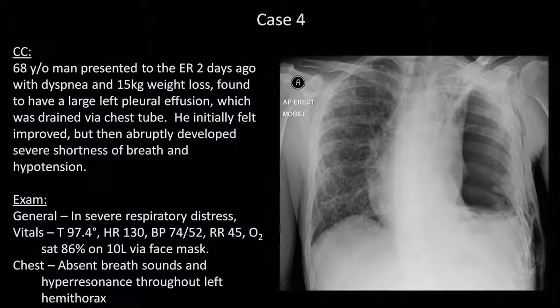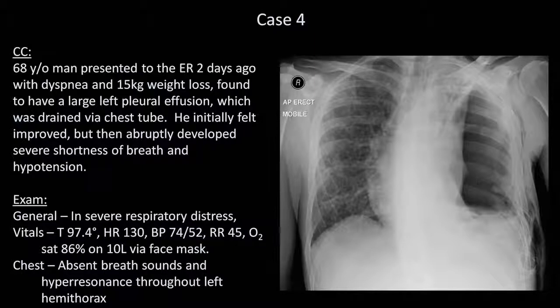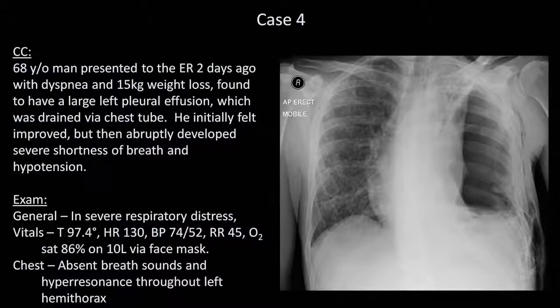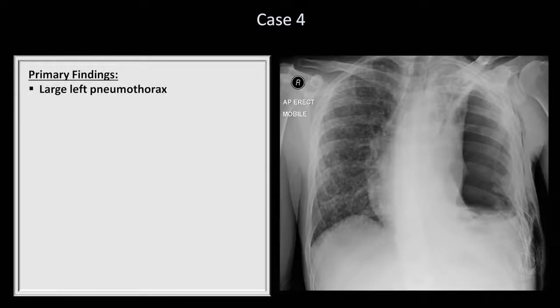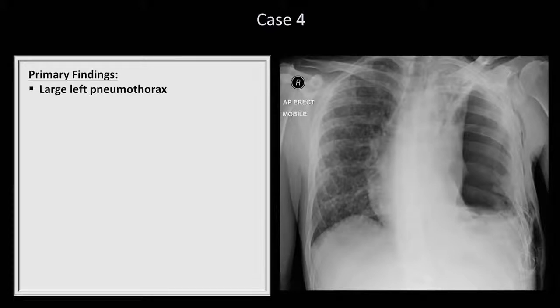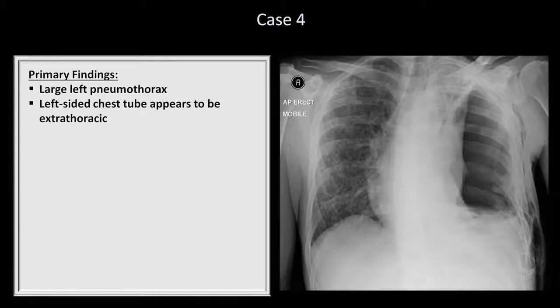Case 4. A 68-year-old man presented to the ER two days ago with dyspnea and weight loss, found to have a large left pleural effusion which was drained via a chest tube. He initially felt improved, but then abruptly developed severe shortness of breath and hypotension. Starting on the patient's left, we can see that where the left lung is supposed to be it is completely devoid of lung markings, thus a large pneumothorax. This appears to be related to some technical problem with the chest tube, which is coiled up at the bottom of the film and appears to be extrathoracic — it looks like it just fell out.